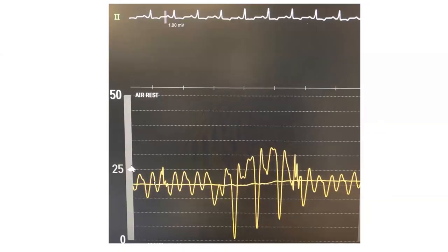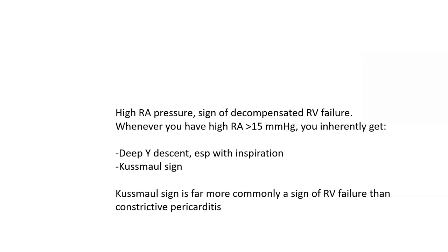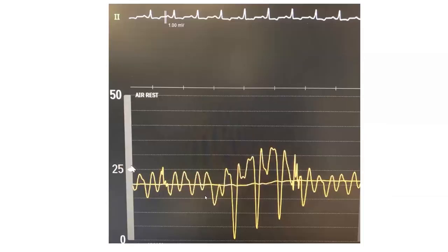Kussmaul sign means the RA pressure mean doesn't change with respiration, doesn't drop with inspiration, and may in fact rise. That's what we did in this patient — we asked him to take a deep breath, and you can see paradoxically, with deep inspiration, the RA pressure rose. In particular, the V-wave became much larger and the Y descent became much deeper. That's a full-blown Kussmaul sign. This patient had severe RV failure from dilated idiopathic cardiomyopathy.